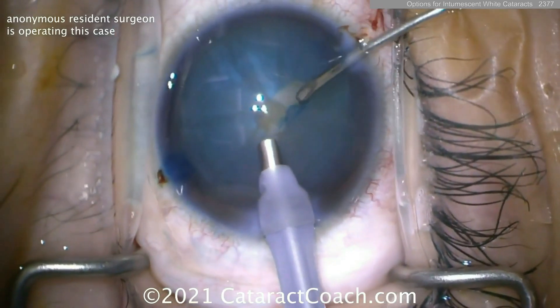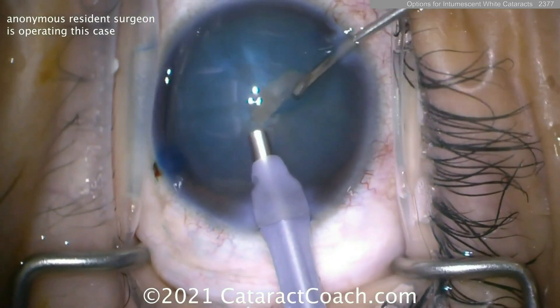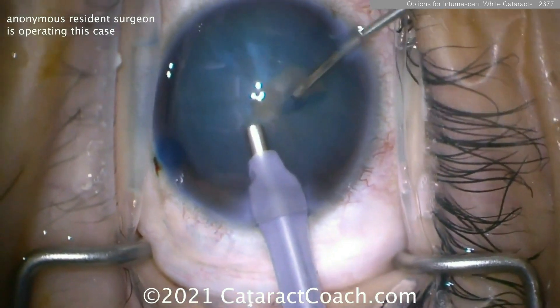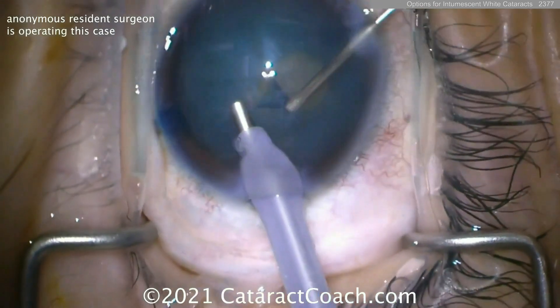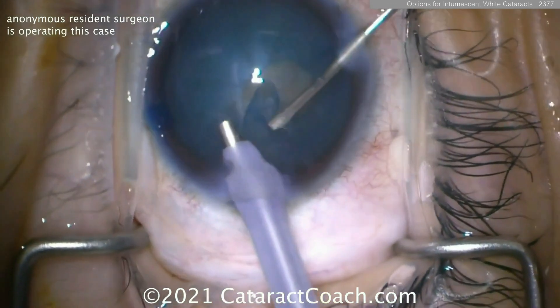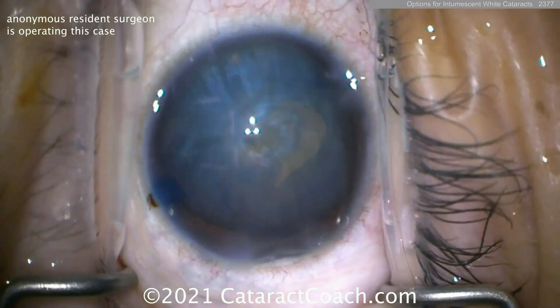Create just some kind of capsular opening — it doesn't have to be pretty, it just needs to be continuous. That's the key. So make some little small rhexis — we'll do the double rhexis technique here. Once we complete that rhexis, there it is. We'll get that mostly completed — that's it. More viscoelastic going inside the eye.